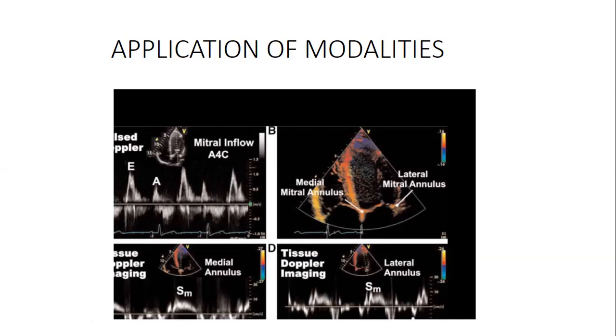So in short, you are going to say the maximum velocity that can be determined is half the PRF. The maximum velocity is this point here. It's that point there. So the maximum velocity that can be determined is half the PRF, and this limit is called the Nyquist limit.